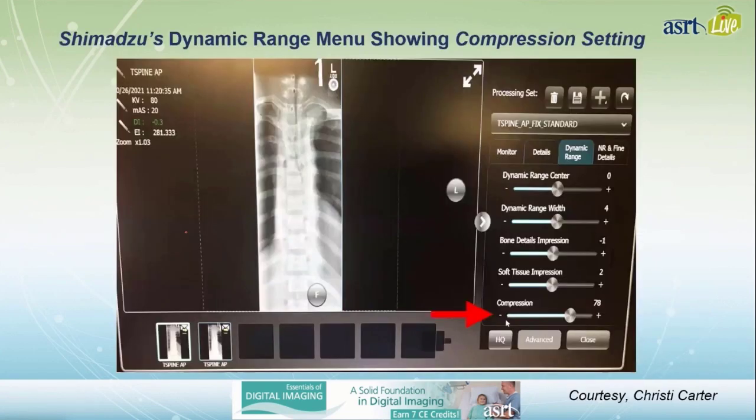This is another one of those practical applications that I think we should be sure to spend time on in class and in our labs. There are several of these things that we can do in our labs now. They're quite different from film screen, but there are things that we can experiment with in our labs that are digital, completely digital in nature, and that are fun to do with your students.